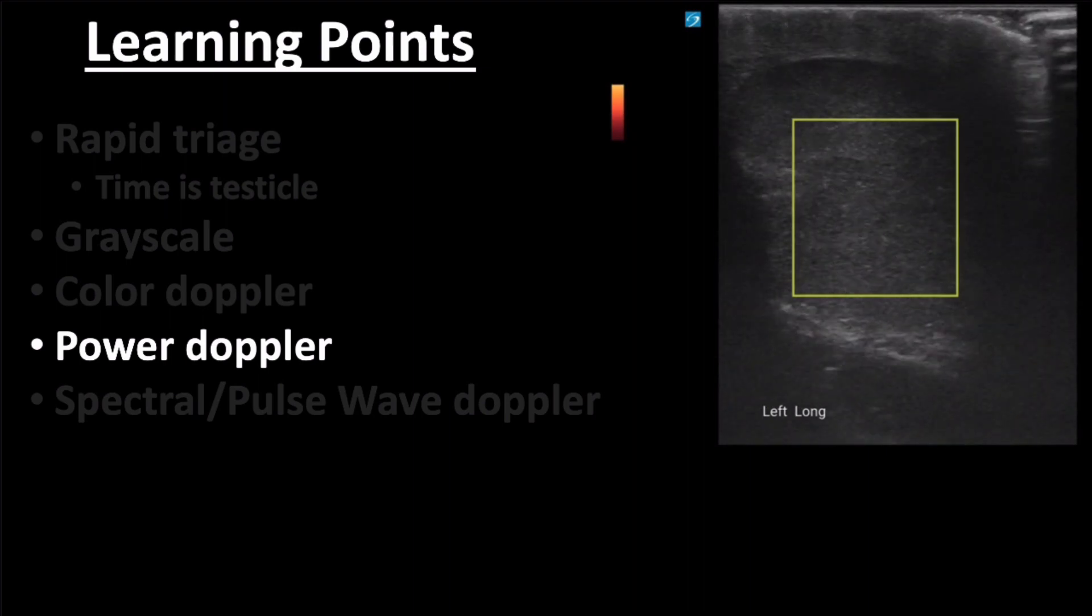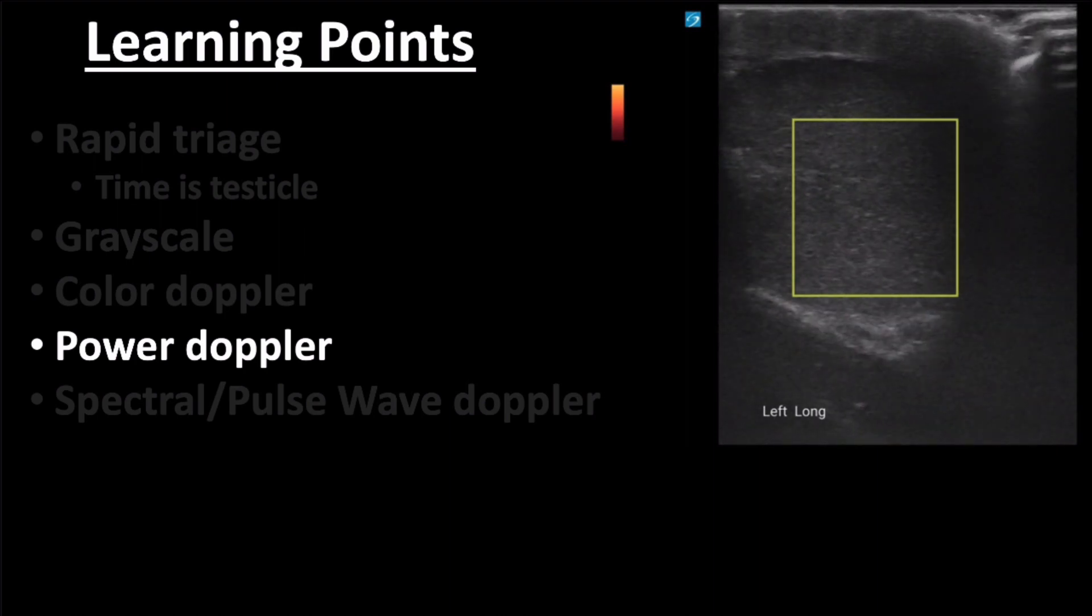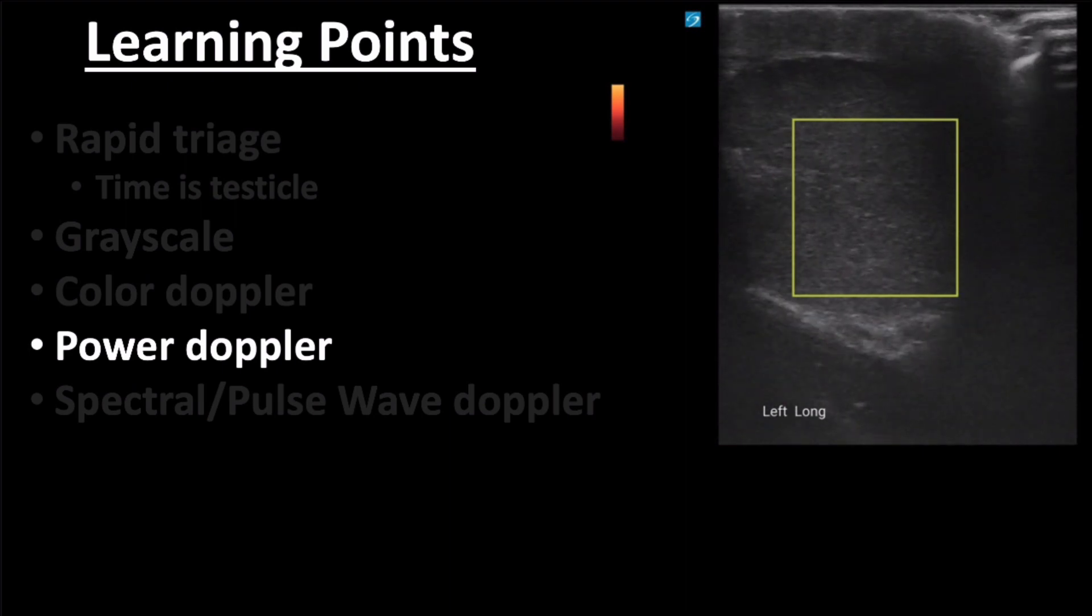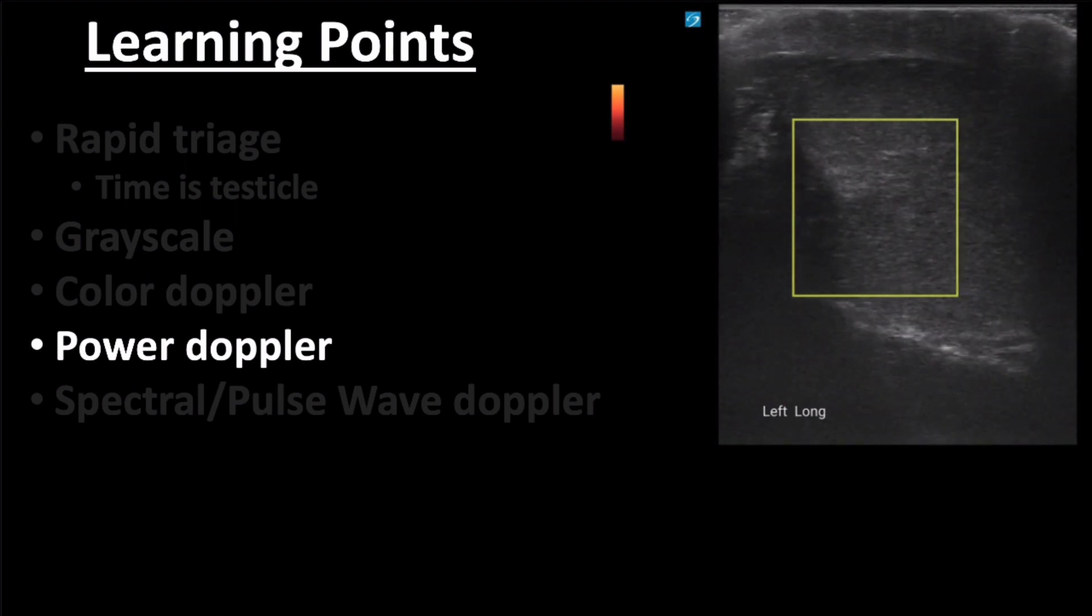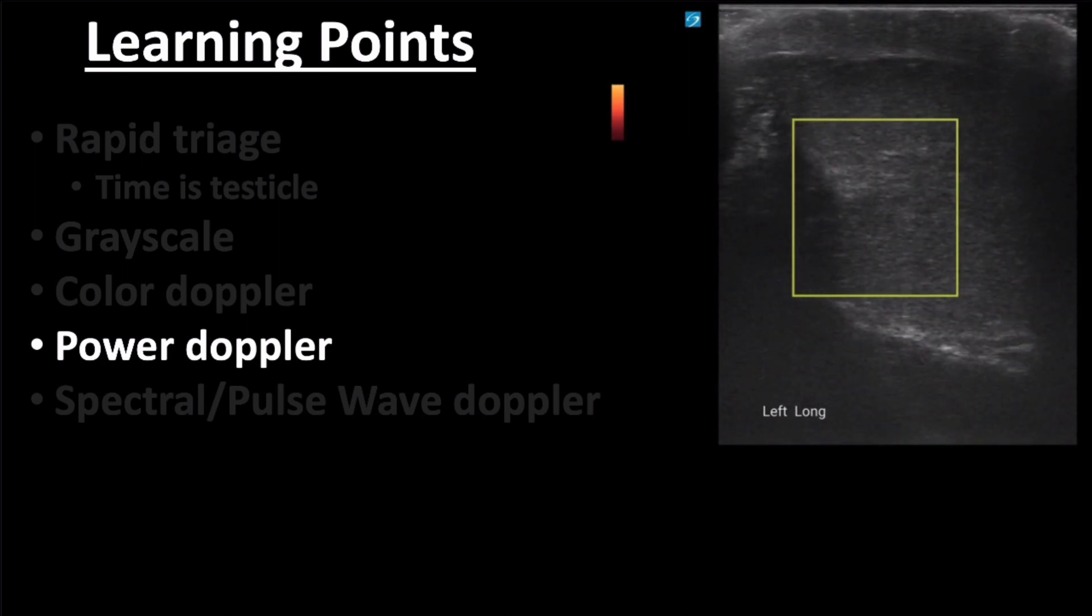Unlike color Doppler, which assigns color based on flow either toward or away from the probe, power Doppler is traditionally direction insensitive, which is one reason it displays increased sensitivities for detecting flow. Many advocate for it to be the mode of choice when evaluating for flow given its reported increased sensitivity.